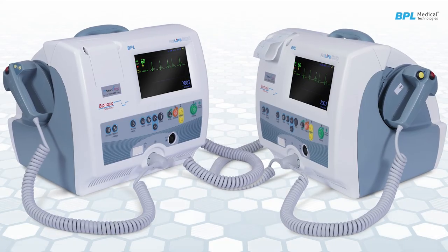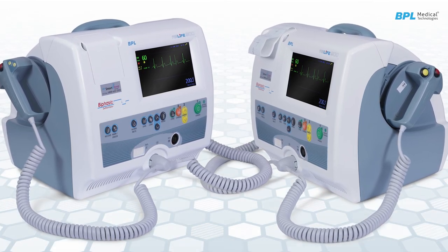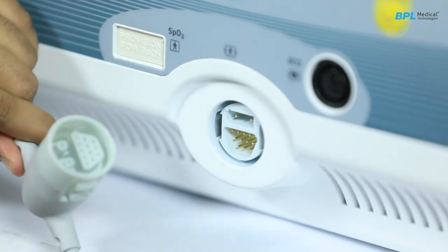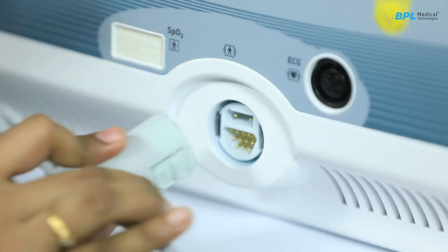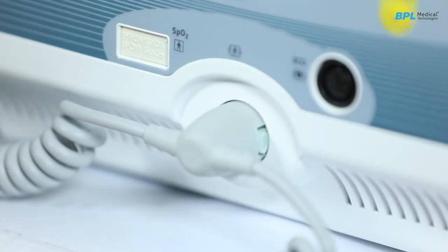To connect the defibrillator paddles, insert the paddles into the holder on the defibrillator unit. Align the defibrillator plug with the defibrillator output socket located at the bottom of the front panel on the unit. Push the plug fully into the socket. The plug locks to the socket with a click sound.